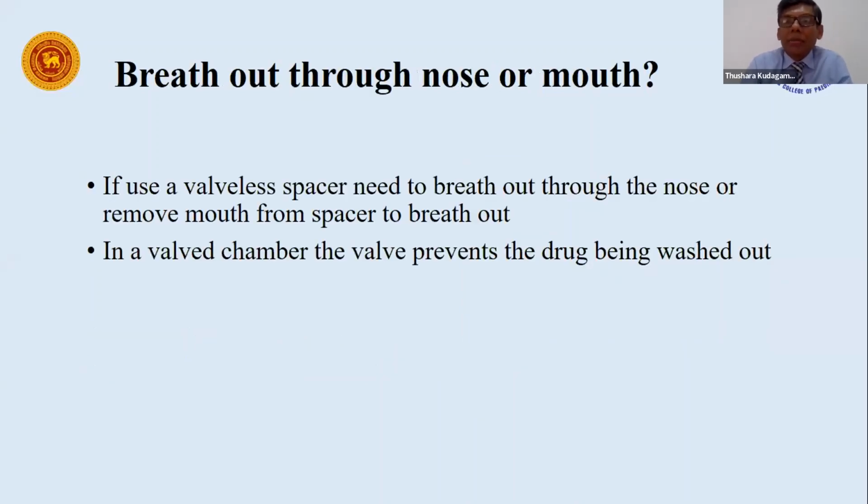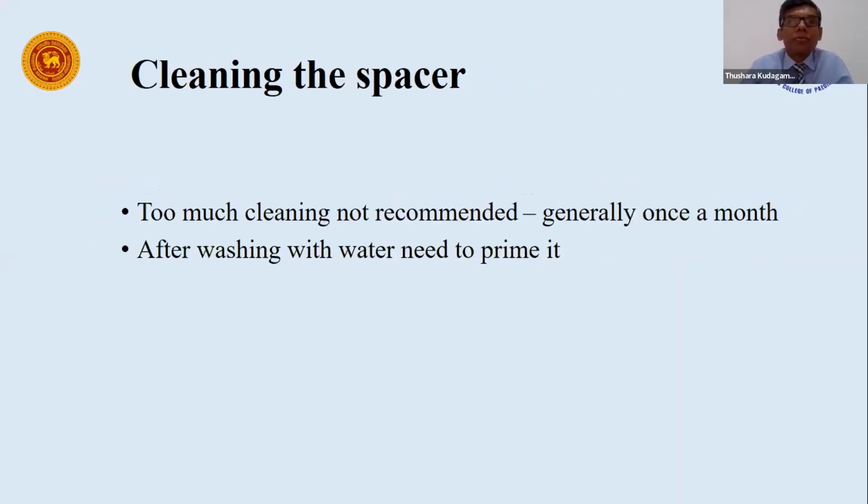Then the other question practically some people have is, should we breathe out through the nose or the mouth? If you're using a valveless chamber, then you have to breathe out through the nose, or you have to remove the mouthpiece of the spacer to breathe out. In a valved chamber, it doesn't matter whether you are breathing through the mouth or the nose.